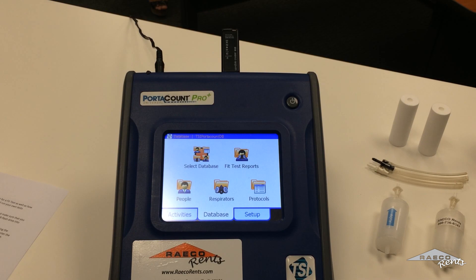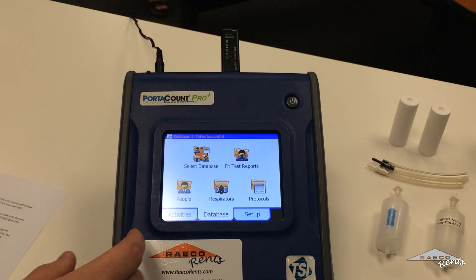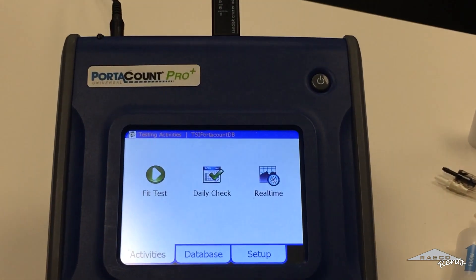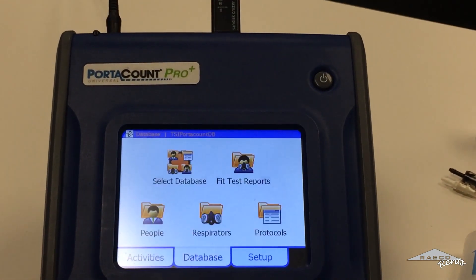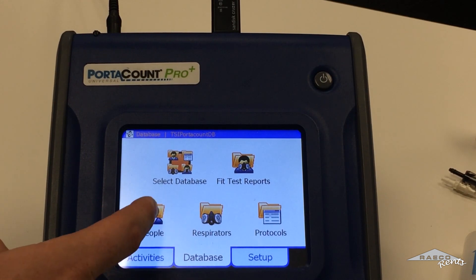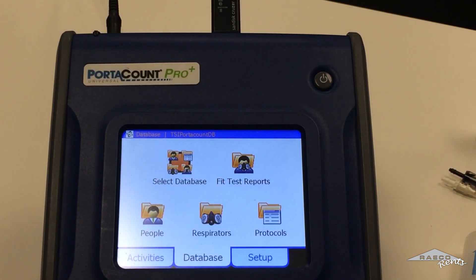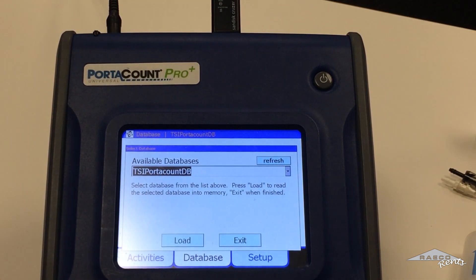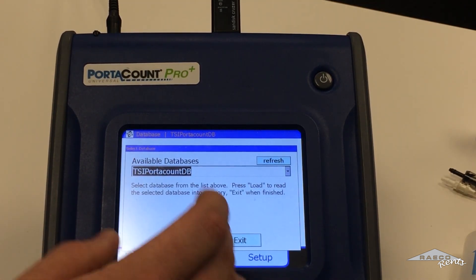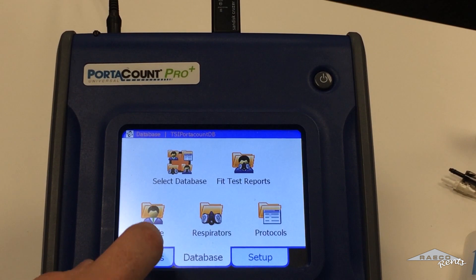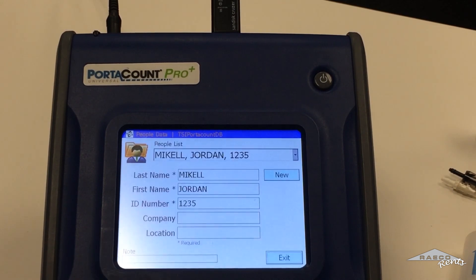So first thing we're going to do, we're going to go to the database. This is your main menu here — just click database. We'll set up the people. Now if you already have a database set up, just go to select database and you can choose that. We're going with the PortaCount DB here.